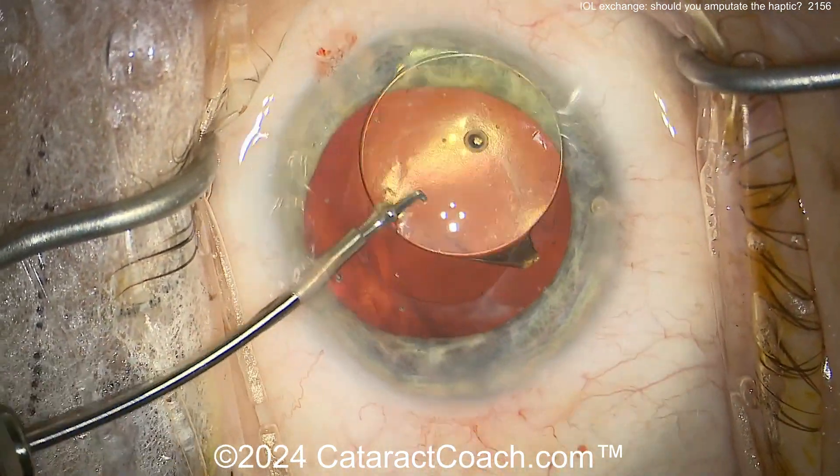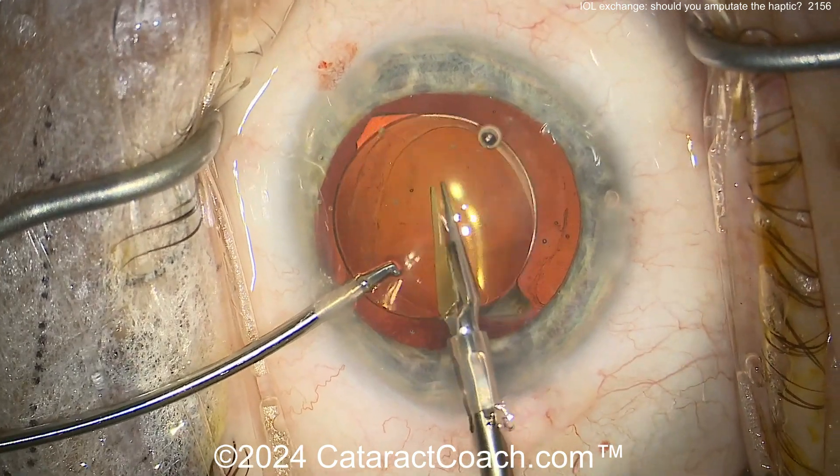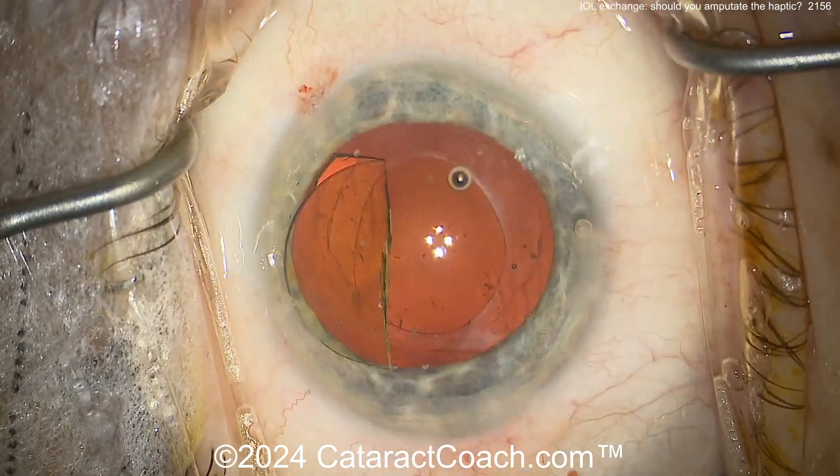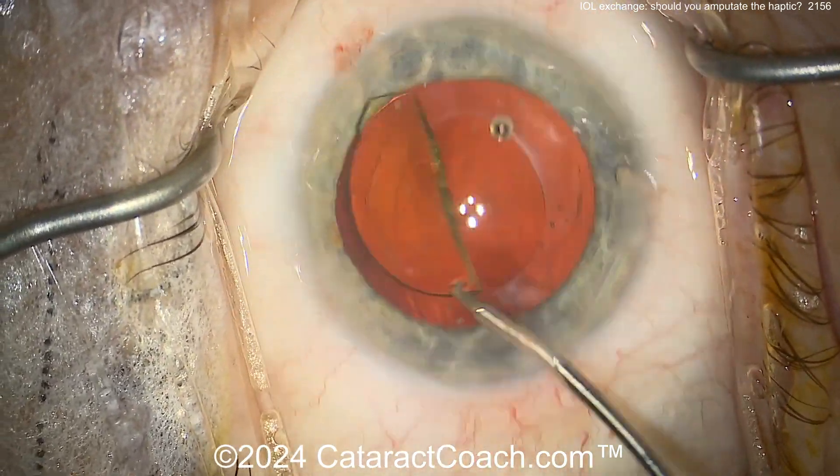I think there's already a little focal zonulopathy there — it's going to be of no consequence. But you don't want to cause any more zonulopathy. You can cut the lens in half using the twisting-out technique, or you can cut it 80-90% of the way through.